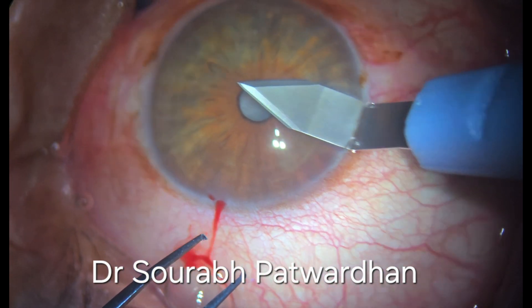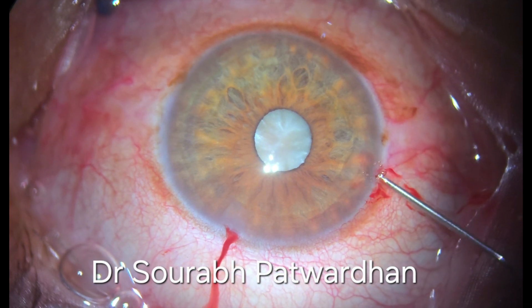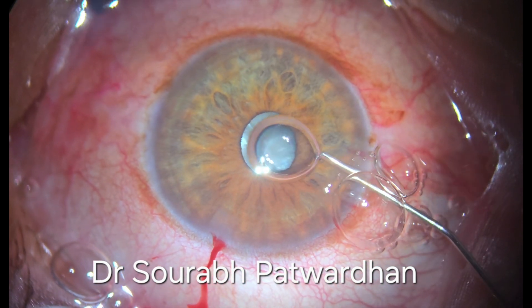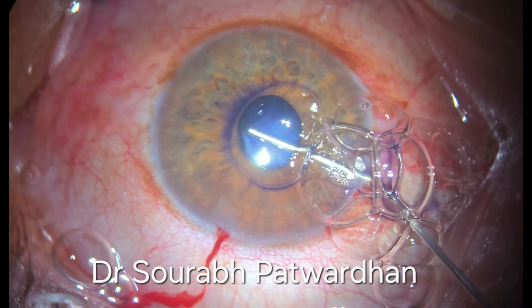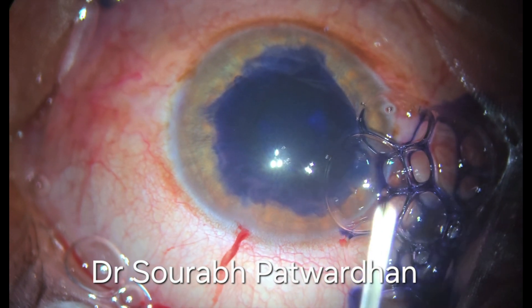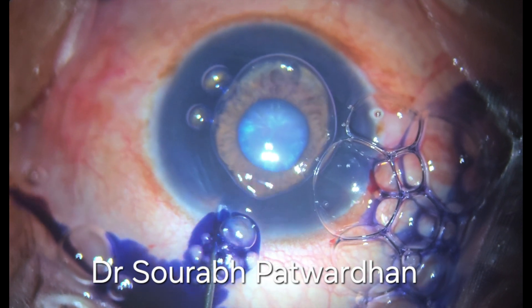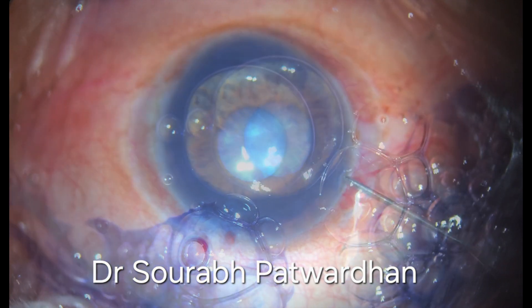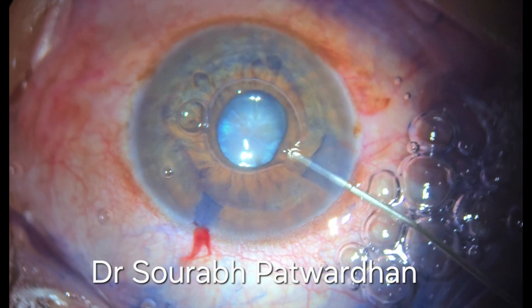You can see that it is a white mature cataract and very very shallow anterior chamber, and that is the reason why the patient was not dilated preoperatively. You can see that the anterior chamber is very shallow and I am trying to stain this capsule under the iris as well by injecting the air and then the dye, and the anterior chamber is very shallow.